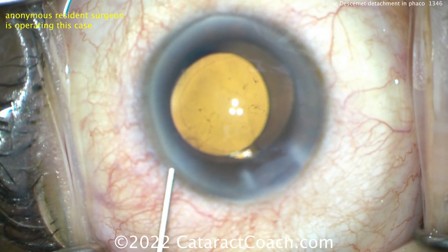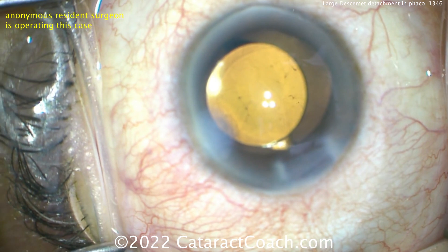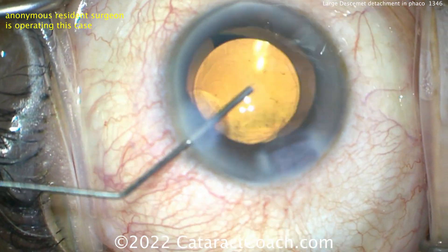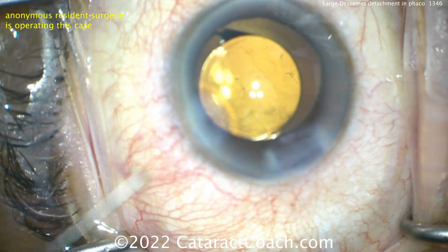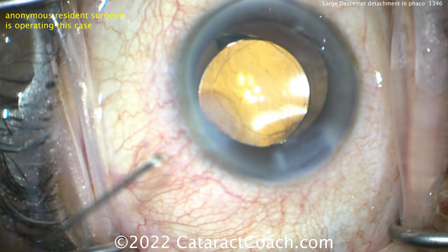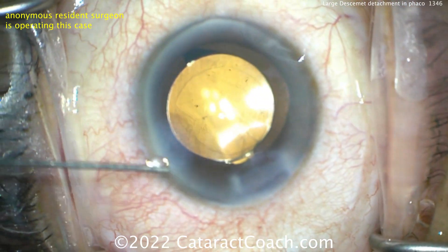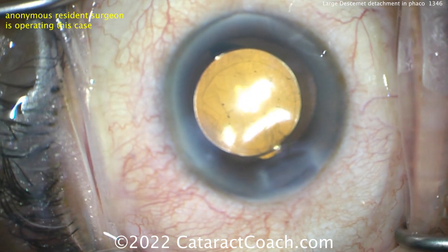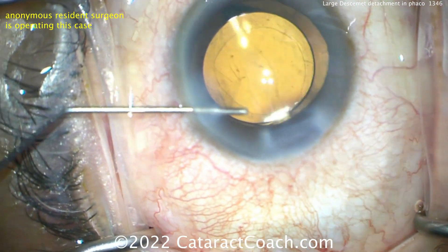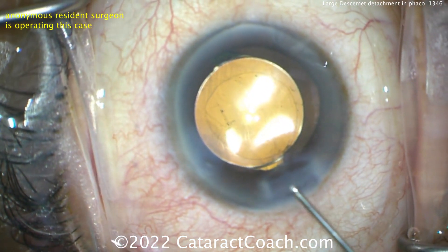So what are you going to do? At this point, you just have to finish up the case. Hydrate the incision. It's hard to see exactly — I wish the resident had used our OCT machine on the microscope to do an OCT scan. You can see a good-looking rhexis and lens in the bag, and great nucleus removal. But this huge Descemet's detachment is obviously going to impact the patient's vision. The resident is trying to figure out what to do. Can I find that Descemet's flap? It's just nowhere to be found.